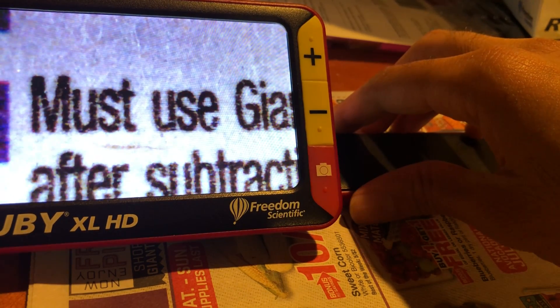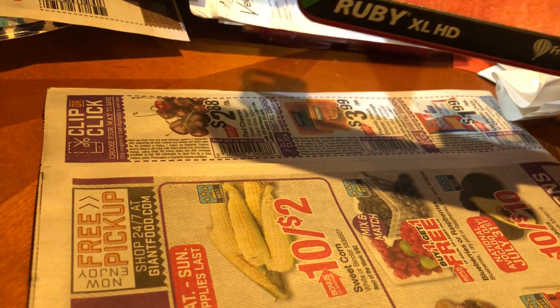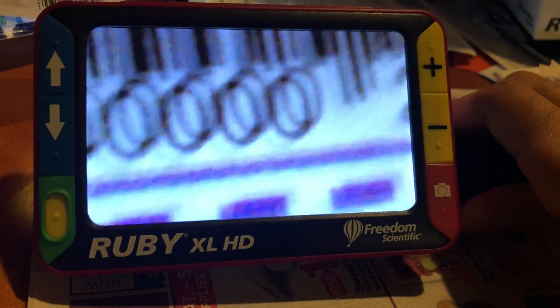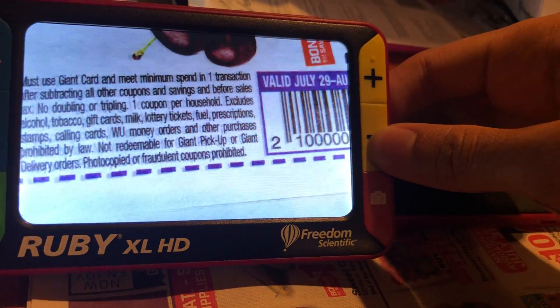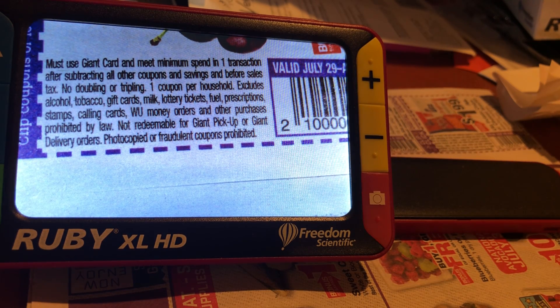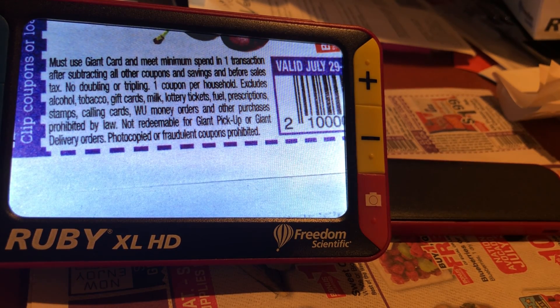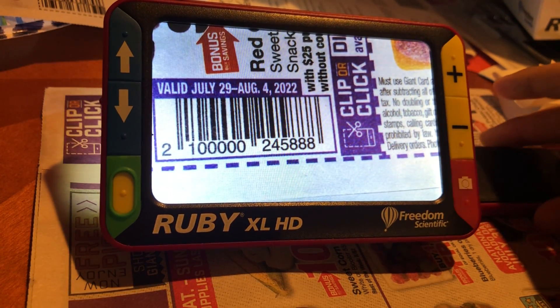Just for comparison, this is full zoom on the first word — and if I move it, you can't even really see the word anymore without the Ruby. When using the device, I personally like to use the stand in conjunction with the handle. This allows me to easily move the Ruby across the page without my hand getting in the way of the screen.